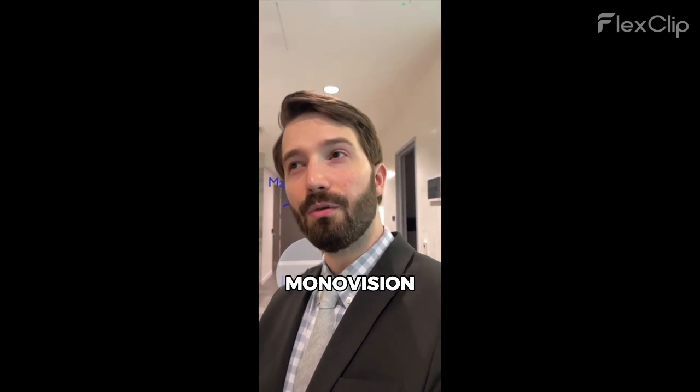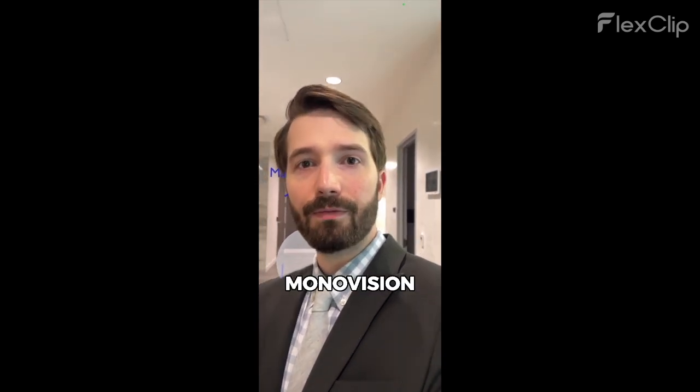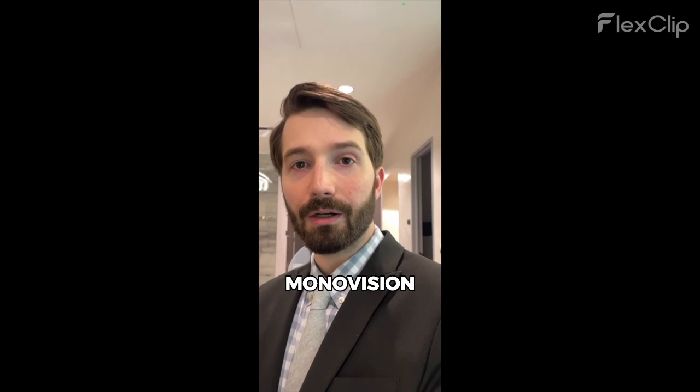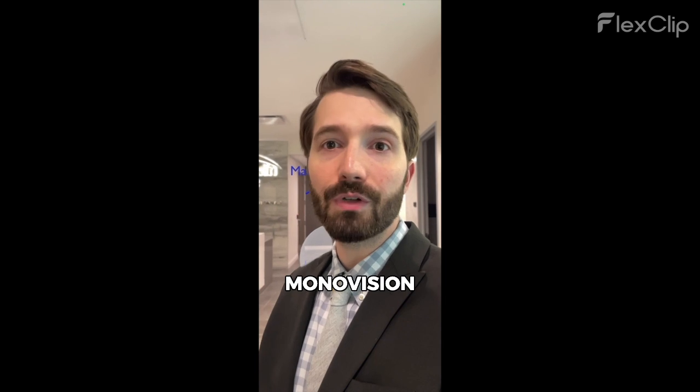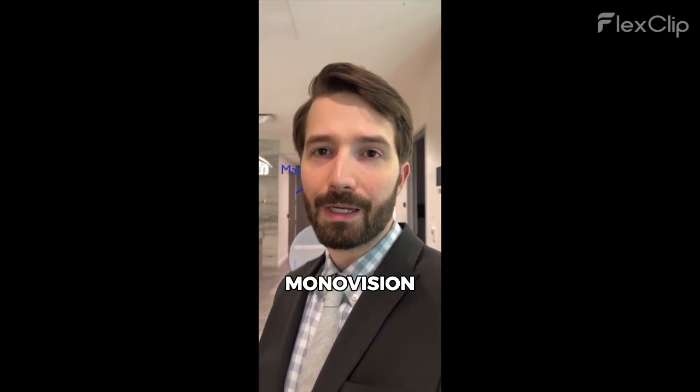The light adjustable lens cannot give a full range of vision from a single implant — it doesn't have the rings or segmented bifocal. So what you can do to help patients get a range of vision is do a monovision setup: one eye set for distance and the other more for near. This is really good for folks who've already had that before, maybe wearing contacts with monovision or had monovision LASIK.